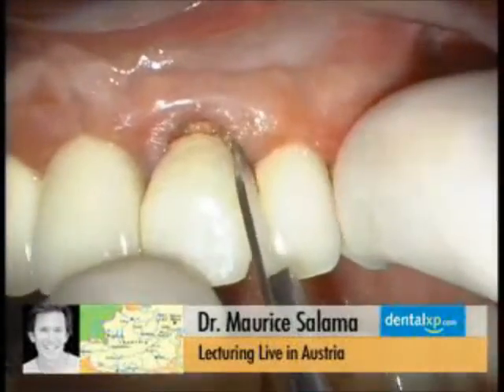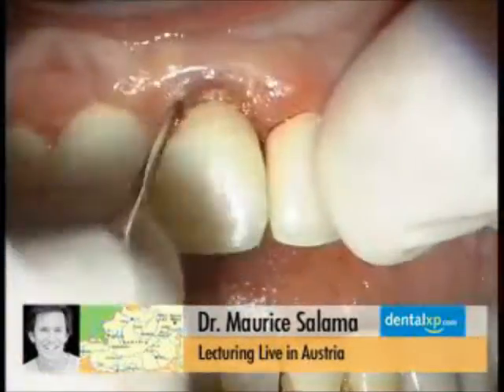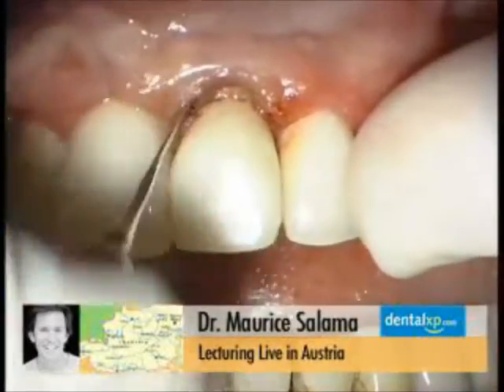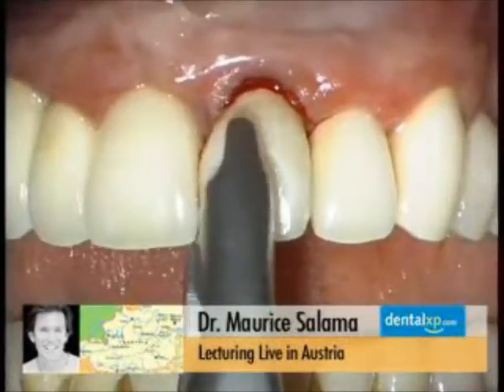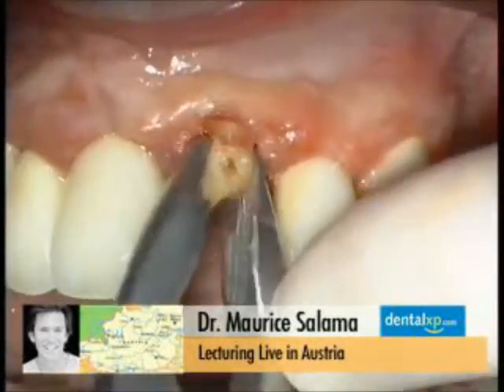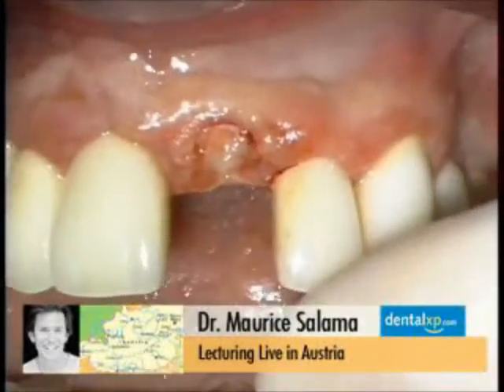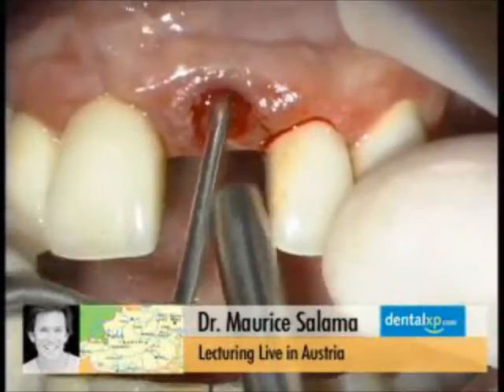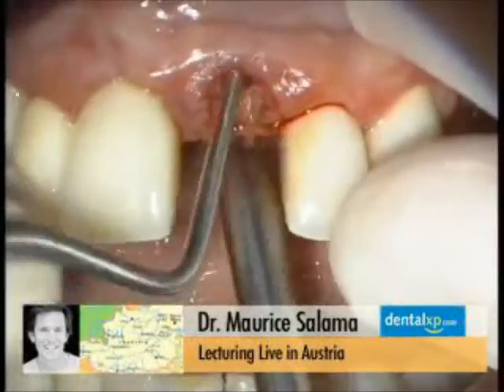He's going to go ahead and extract the left central incisor, problem a fracture, and we went ahead and extruded this tooth, and once the extrusion was finished, you can see that we brought down the bone prior to this visit, and now Henry's going to go ahead and do an immediate extraction with immediate implant placement based upon the stereolithic guide and the pre-diagnostic CAT scan images that allowed us to plan both the surgery and the restorative phase from inception.